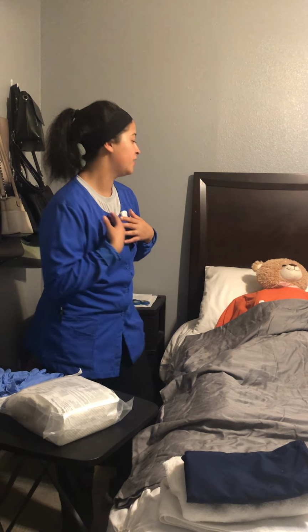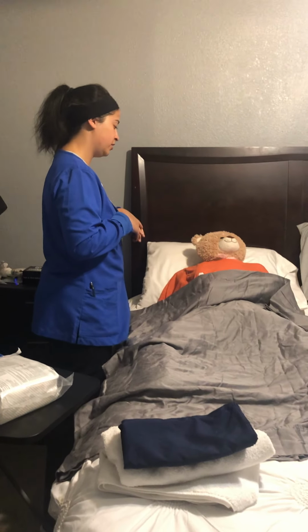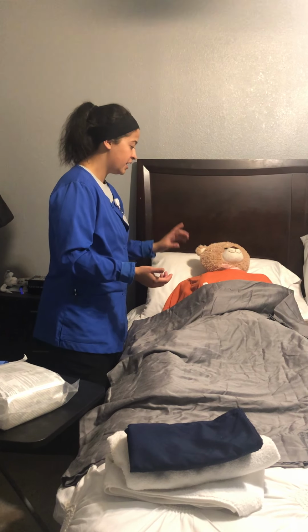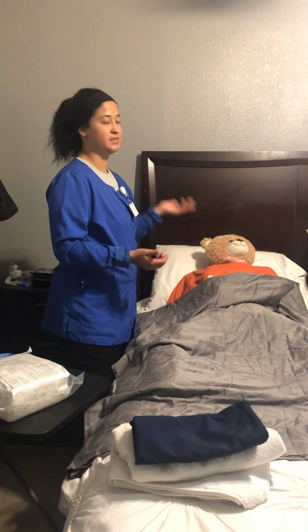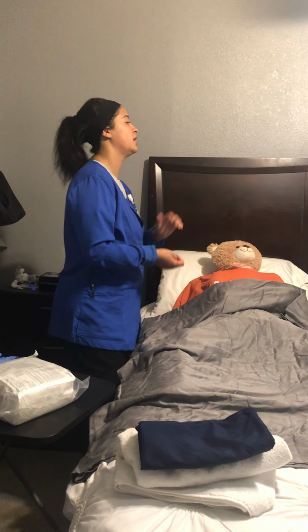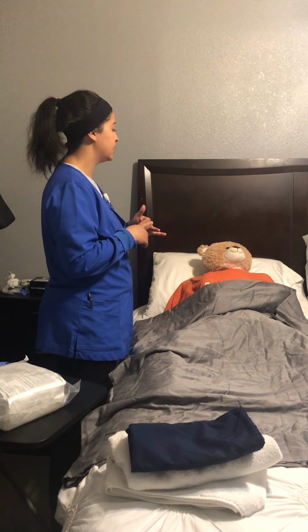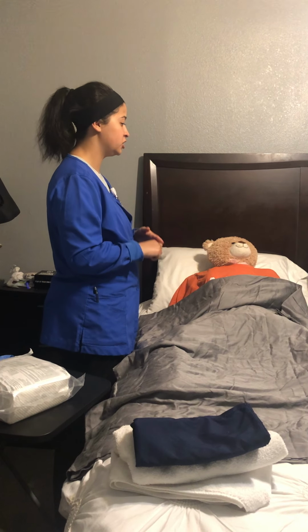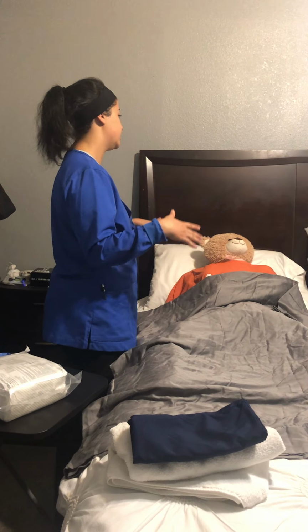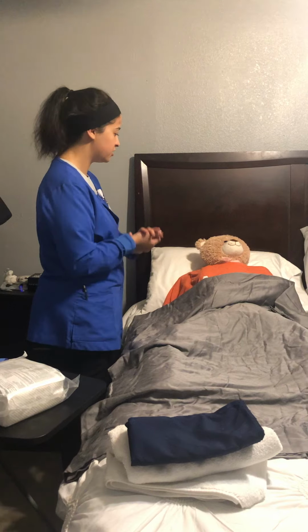I would introduce myself. Hi, my name is Sierra. I'm going to be your nurse today. Can I get your first and last name and date of birth? I'm going to identify my patient with 2 identifiers. Her name is Hannah Martinez. The date of birth is 7/21/95. Okay, Miss Martinez, do you have any allergies that you're aware of, specifically to latex, iodine, or shellfish? No? Okay. We are going to be placing a catheter in you today to release some of the tension in your bladder. Do you have any questions before we get started?